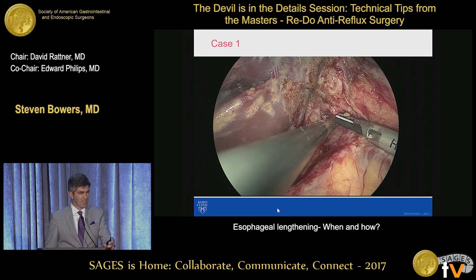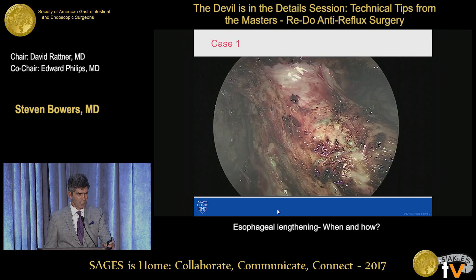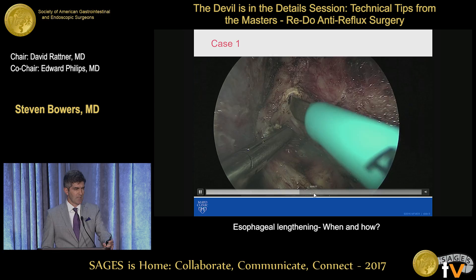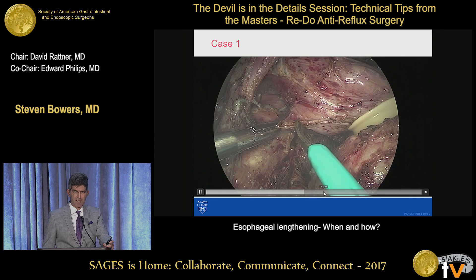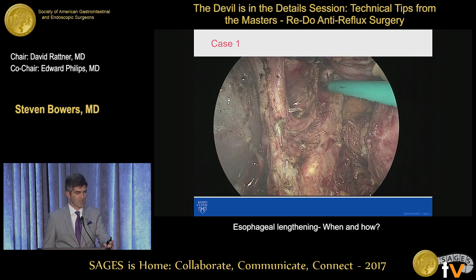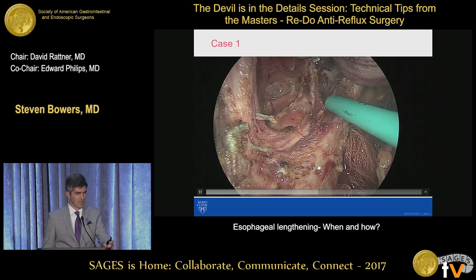And then we start at the base of the crus closure. Then we can always try to find a plane into the posterior mediastinum, and we're going to just do a very careful dissection of the posterior mediastinum. Here we've entered the posterior mediastinum and we're dissecting the adhesions off the base of the left crus pillar. And then you can see both the hiatus kind of taking shape, and we've taken most of these adhesions down.